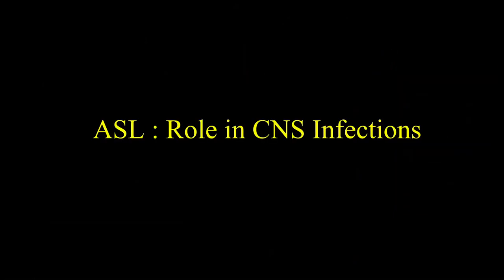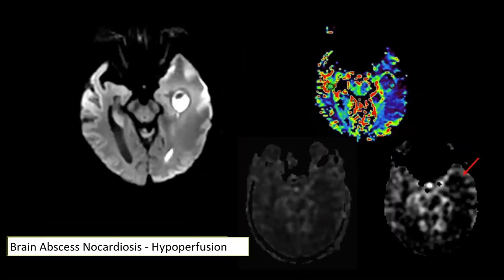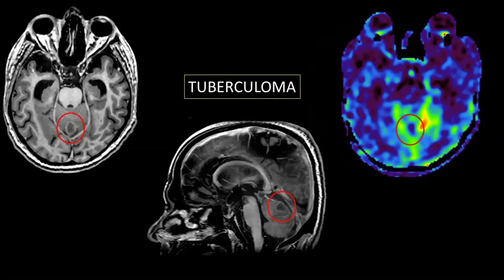Coming next to the role of ASL in CNS infections. Most infectious etiologies are hyperperfused, as we see in this case of a brain abscess with typical features including restricted diffusion. Not very difficult to diagnose on routine MRI, but ASL will definitely support the diagnosis by depicting hyperperfusion and limiting differentials. Another example — a very small tuberculoma — emphasizes that though the area of abnormality is small and in the posterior fossa, ASL is sensitive enough to show hyperperfusion.